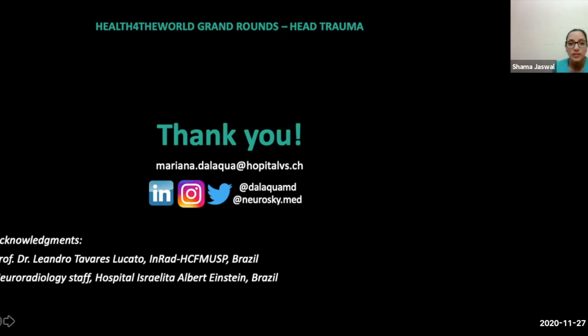So the first question is, should we always report the 23% of missed intracranial findings on X-rays and suggest CT scan? In fact, my message here is that we shouldn't do X-rays at all in the context of head trauma, but if you absolutely have to report it, then yes, you should absolutely write and protect yourself and the patient, saying that this kind of imaging is not enough to completely exclude an important lesion, and absolutely suggest a CT, yes. Thank you. So when you see epidural and subdural hematoma, do you report the volume?